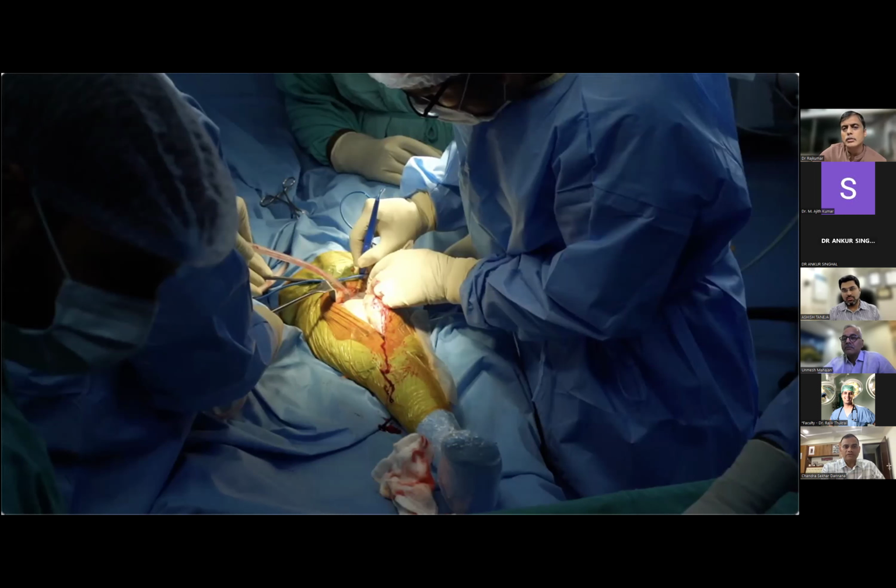Can I ask a question, please, to the faculty? Yes. How many of you actually use this technique where in the spacer itself, you make multiple pock marks, indentations in the spacer? Because there is a paper which has shown that the antibiotic elution is much higher, because it increases the total surface area of the spacer itself. Okay, good. That's multiple indentations while it is setting, which increases the total surface area, and total antibiotic elution has been shown to be more than the ones where you make a smooth spacer.